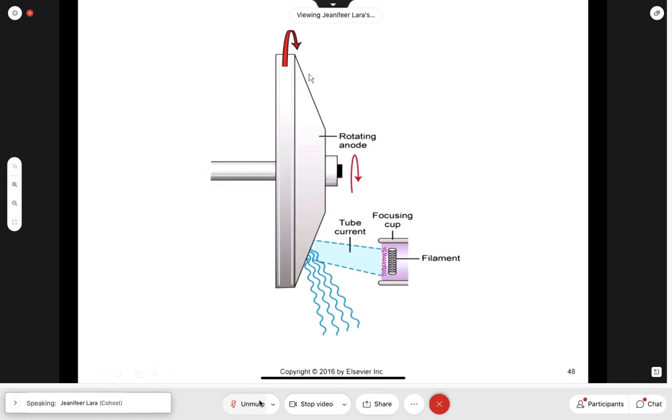So when you go back and think about it, the voltage that is being applied, which is just still electricity, is going to generate this high attractiveness or positivity of the anode. Eventually, kVp, which charges our anode, will determine how fast we get electrons to flow, or tube current. The potential difference. You're right, I think I went over that. So the kVp, or the anode attractiveness, is what creates that potential difference.